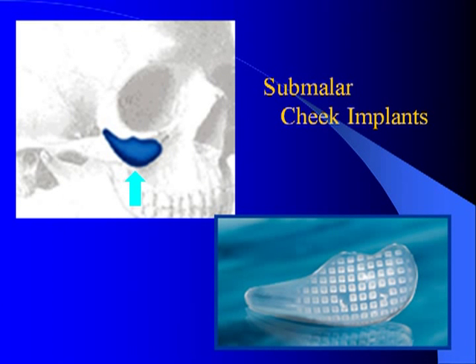This is a not very well known type of cheek implant because it does not sit in the classic position on the prominence of the cheek, but rather sits more on the underside, adding volume to the upper buccal fat pad area where some of the tissue is lost. This implant is historically well known to be used in the early facial aging patient to create a little uplift of sagging cheek tissue in this area.